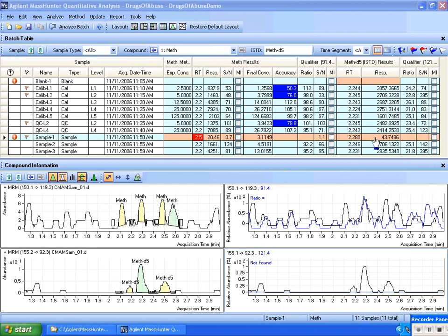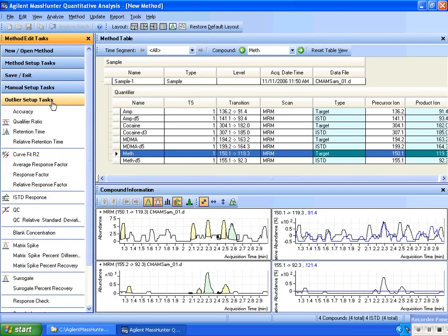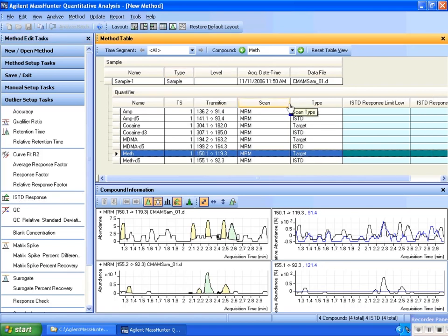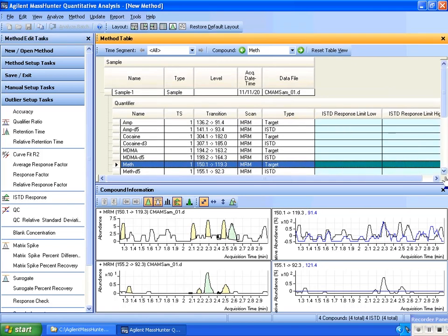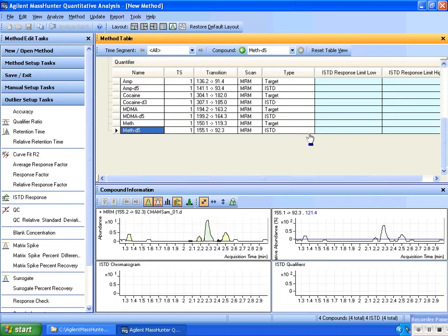So what I want to do next is go over to the method editor and adjust an ISTD outlier to help me. Now, I will give myself a little bit of room here and then expand the outlier section. Right here is the ISTD response. So zeroing in on the ISTD response, I've got two columns that are involved here, the methamphetamine. Here's the methamphetamine deuterated ISTD.